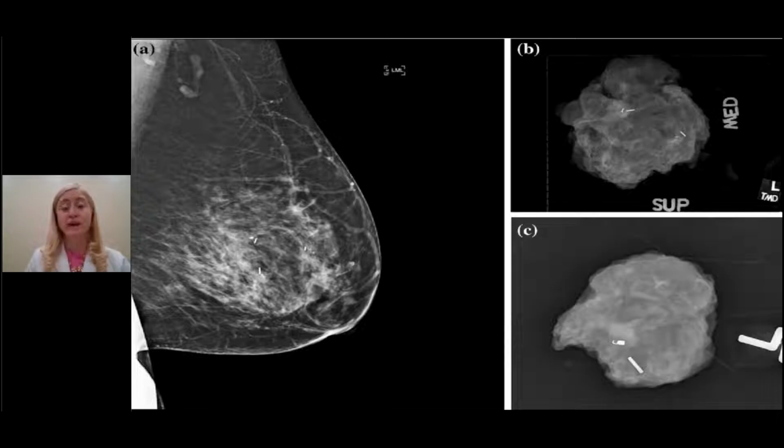So one thing that's great about this system is there's no extra capital that's needed in the OR. You already have your probe for your lymph node assessment. So use this probe and just switch the setting, and it will identify your I-125 radioactive seed. The seeds are placed similar to a breast biopsy, and they usually target the calcifications, the mass, or the clip that's already there. And you can see on the left of your screen, the patient had at least 2 seeds put in there to identify the lesion.